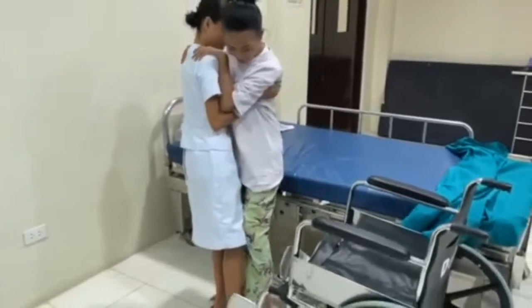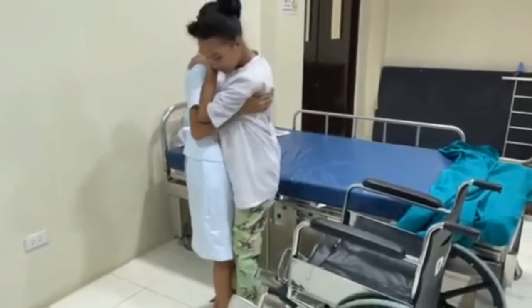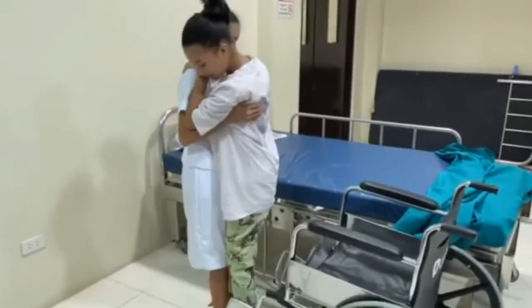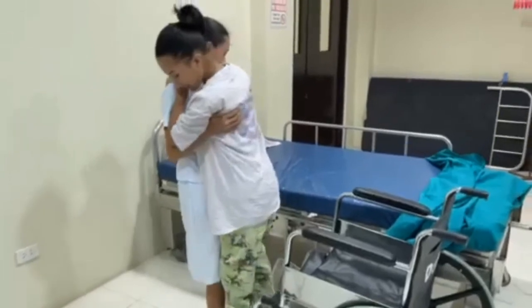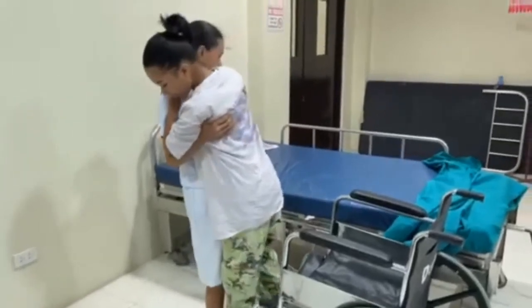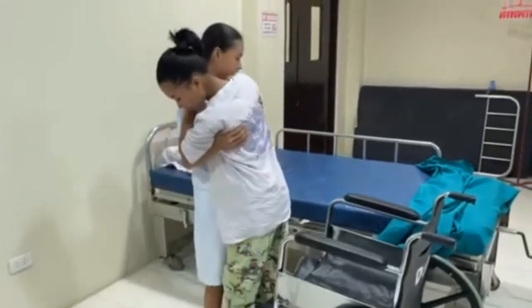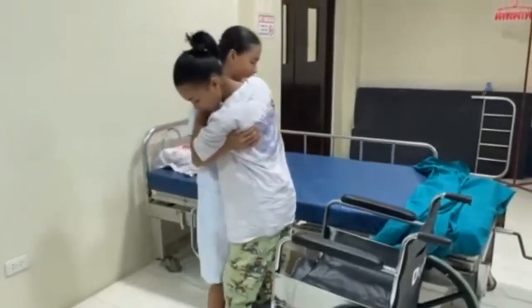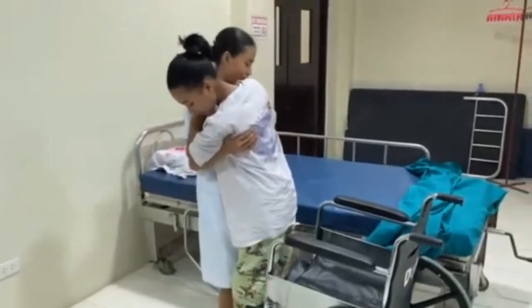Step 6. Assist the client to a seat. Move the wheelchair forward or have the client back up to the wheelchair or desired seating area and place the legs against the seat. Make sure the brakes are on. Have the client reach back and feel or hold the arms of the wheelchair.